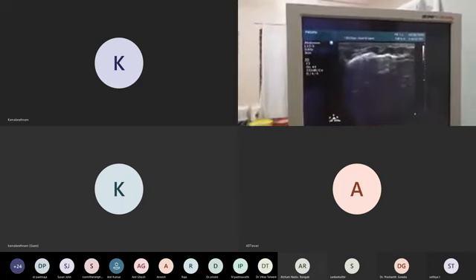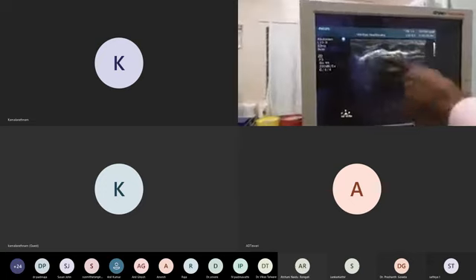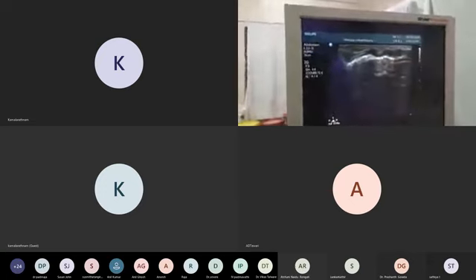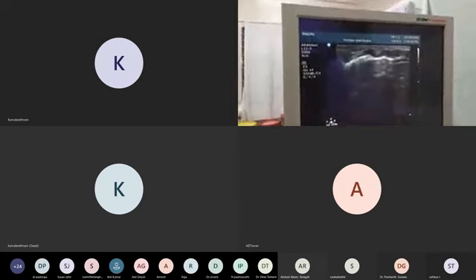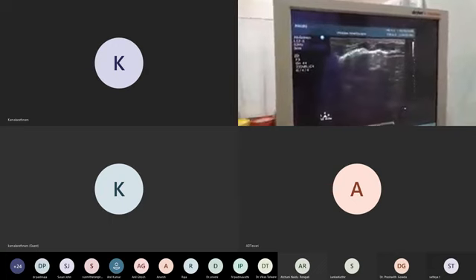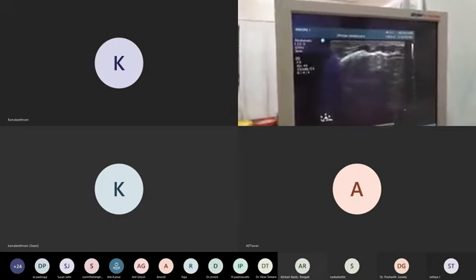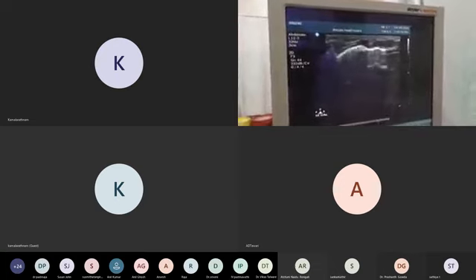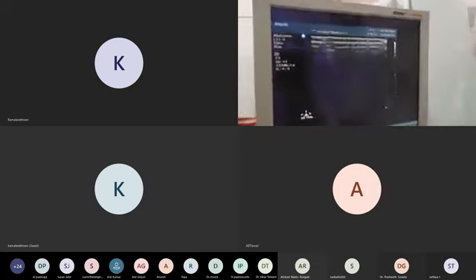So do you think there is pneumothorax? If the lung is moving like this, the visceral pleura, this pleura, then there is no pneumothorax. See how many seconds it took? It took not even 1 second or 2 seconds. With an X-ray, we have to go down, send a first year PG or intern, call her, call this. See, there are so many headaches.